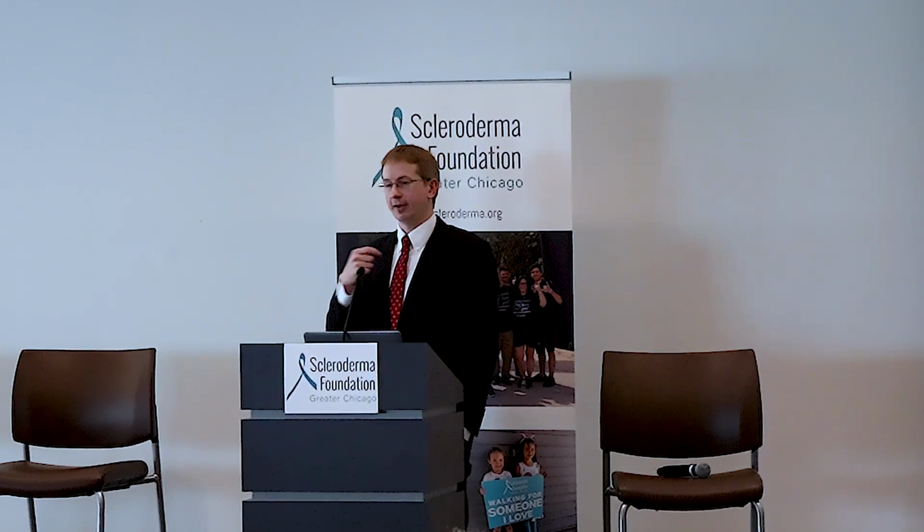But I think there's enough interest from people organizing and performing trials that soon we will be able to use ultrasound by people who have received essentially a cursory training. We'll say you're going to check these 5 spots, you're going to put the machine with this much gel, and you're going to hold still and take this picture with these settings. That, I think, is very feasible. I think you could train a dozen rheumatologists in an afternoon to go back to their sites and do that.